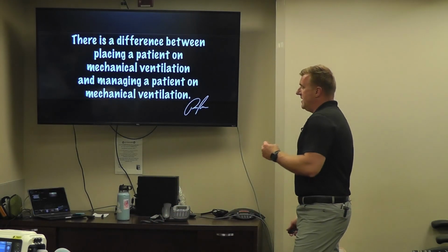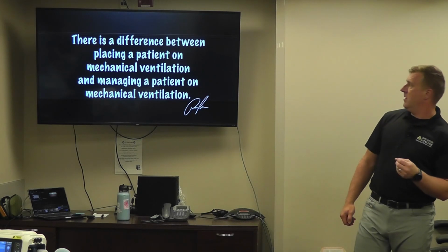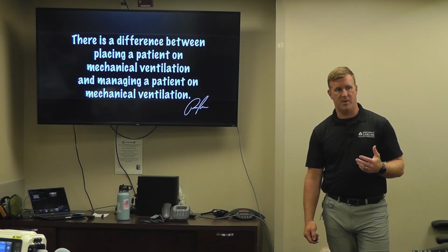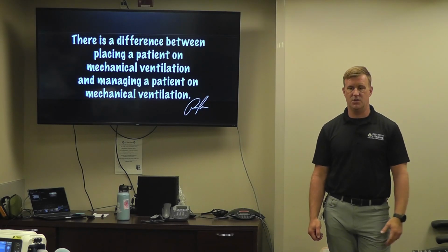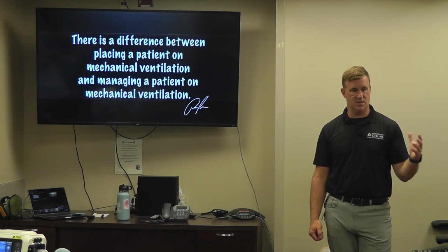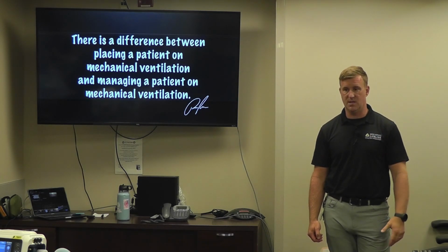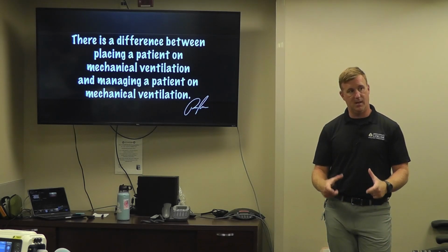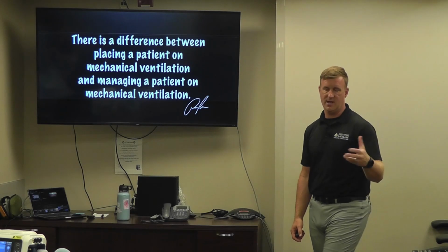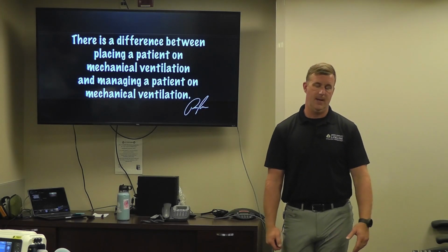All right. Then the big thing is there's a difference between placing somebody on mechanical ventilation and actually managing somebody on mechanical ventilation. All of these ventilators in front of you, the LTV, even some of the super basic ventilators, and if you guys are interested during a break or whatever, I can go back to my office and get one of the new vents that we have. There's a footprint about this big, and it's designed more for disaster and 911 and stuff like that.